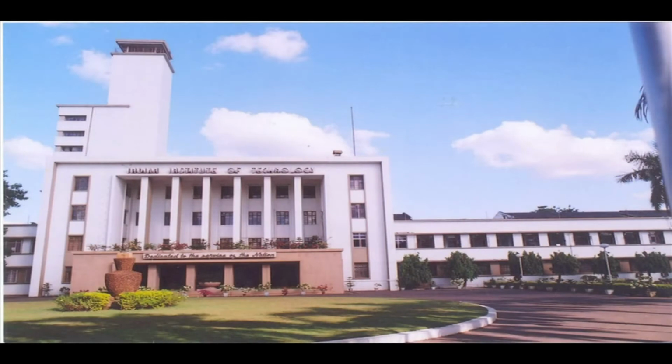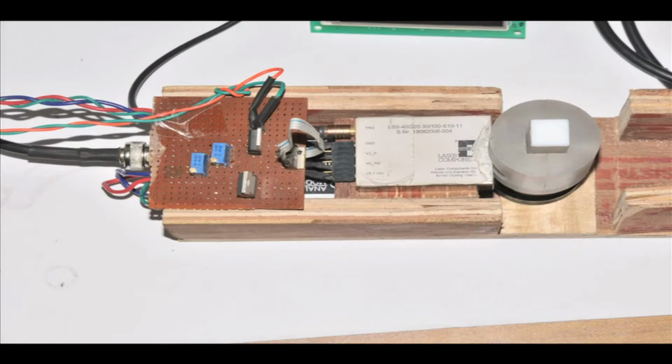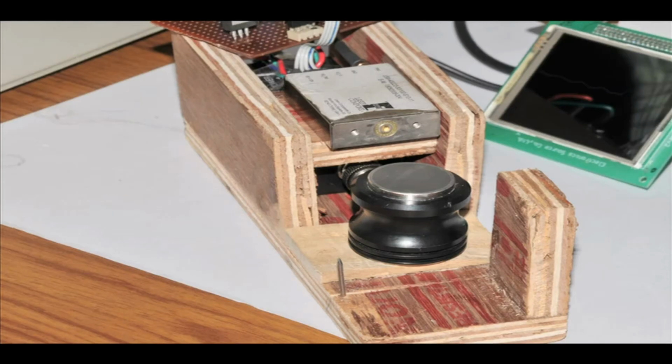At IIT Kharagpur, we are researching a potential non-invasive blood glucose measurement technique based on photoacoustic spectroscopy. The developed glucose measurement apparatus consists of an optical excitation source, a laser, which excites the glucose molecules within a tissue sample. Excitation from the laser generates a photoacoustic wave in the sample, which is detected by a piezoelectric transducer placed in contact with the sample.